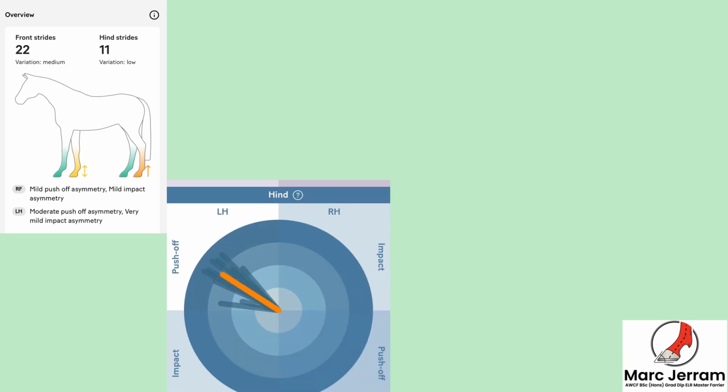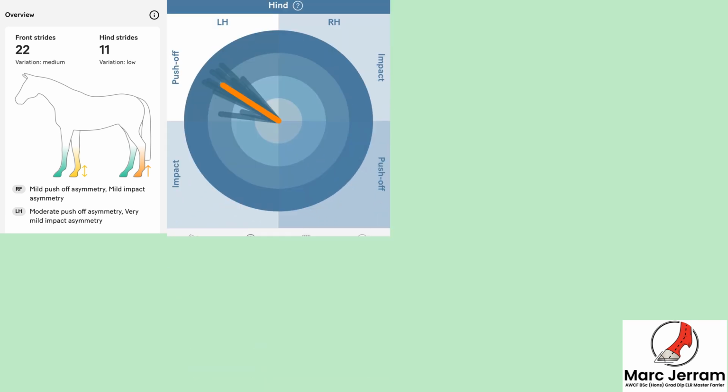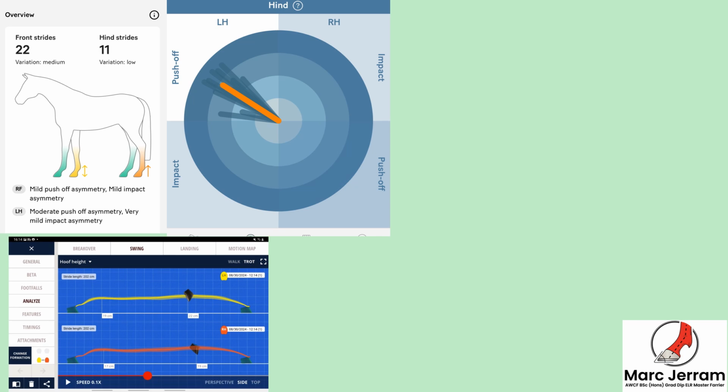Okay, so what I'm going to share with you now is a particular horse that was referred to me by the veterinary surgeon, who does have a left hind limb and a right forelimb issue, but mostly the left hind was the main thing for me. Okay, I know this horse had historically suspensory issues, and subsequently was a good high performing show horse, so I wanted to make sure I could cover all bases.